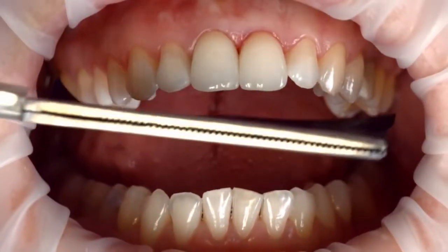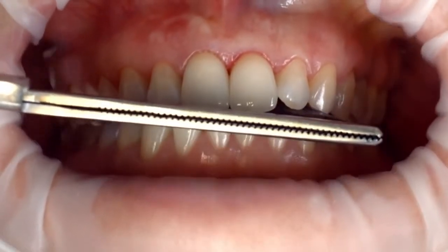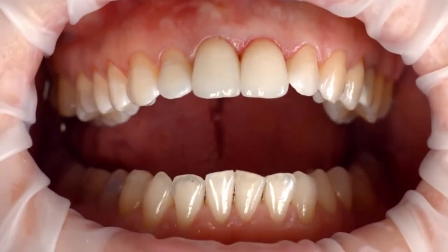When trying in the permanent restoration, check the shade effect, accuracy of fit, and occlusion of the restoration.